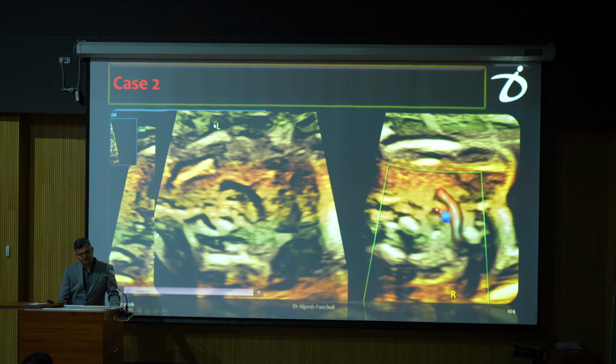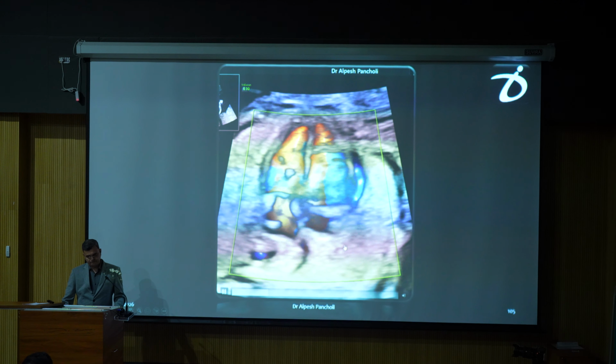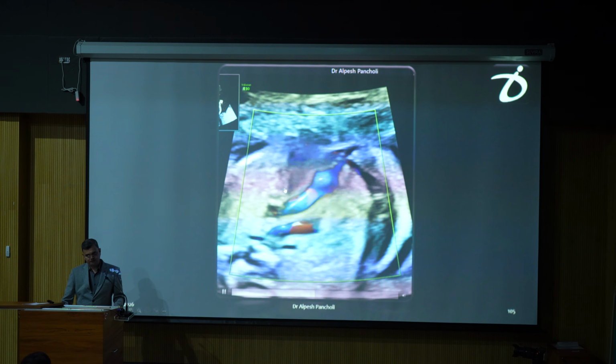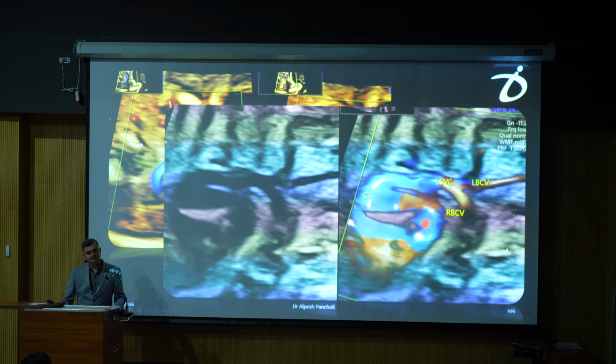So here this is the left. Normally the flow of the left brachiocephalic vein is left to right, but here it is from right to left, reversed. So this is the color Doppler image video showing the same. You have this and there is a reverse right brachiocephalic vein. So here there are 2 different opposite colors. This is the right subclavian artery showing blue and the brachiocephalic vein in red. So there is only one diagnosis, that is absence of right SVC with persistence of left SVC.